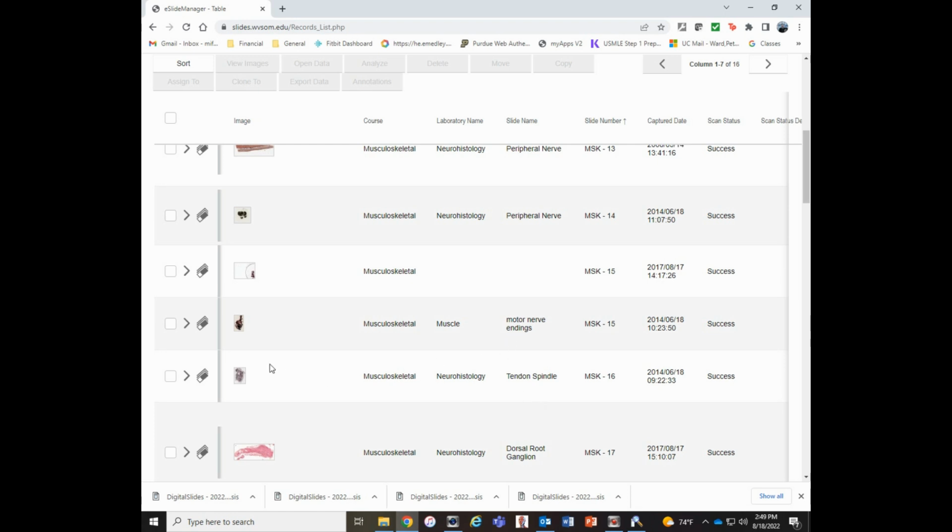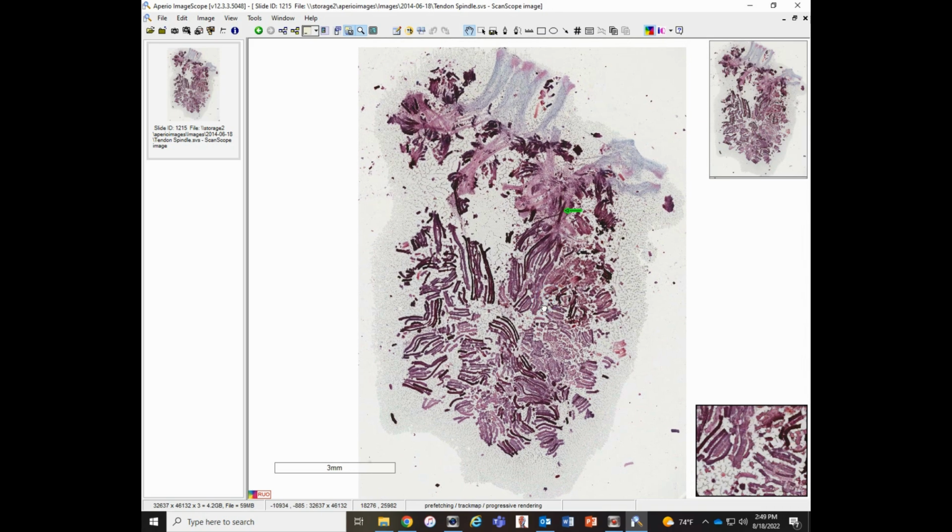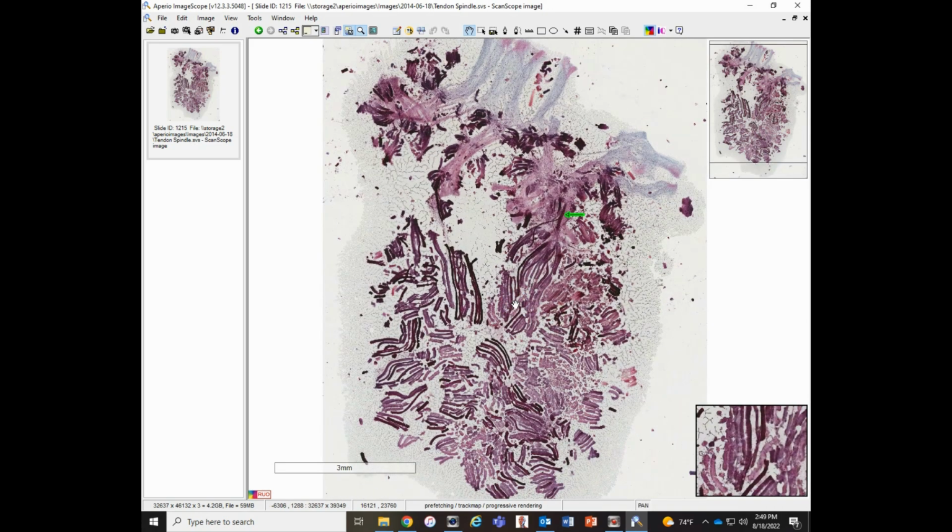Alright, from here we have one other quick aside before we're done. We've seen the muscles, we've seen the nerves, we've seen the tendons. Now we are going to take a look at something that's not in your self-guided tour, because it's really not something that you can spend a lot of time looking at.